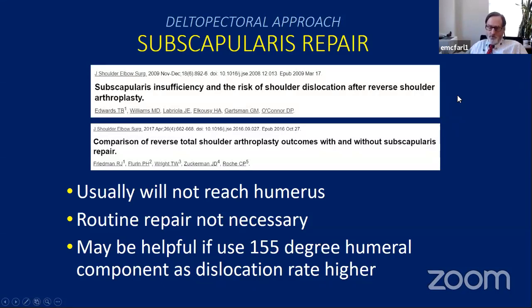Sometimes it just won't reach because it's deficient or it's gone. So the good news about reverses is you can actually live without the subscapularis. The current system I use with Stryker, because it's somewhat lateralized or has an onlay humeral component, onlay metaphyseal tray, most of the time the subscapularis won't even reach. And I've not found that patients complain about that very much. And the good news is that with these newer designs, instability is a little less common. So whether you put the subscap back or not is really almost a personal preference.